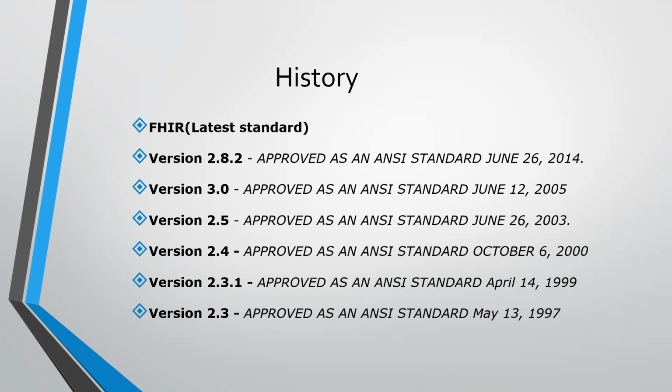And it is not a compulsion from the federal government anyway, right? So that is one of the reasons people did not upgrade to 3.0. And the second reason they did not upgrade to 3.0 is it is very complicated. Version 2.x can be understood even by doctors, if they take a deeper look at it.